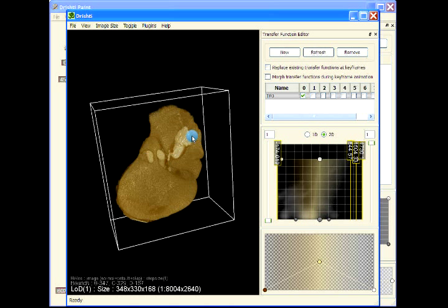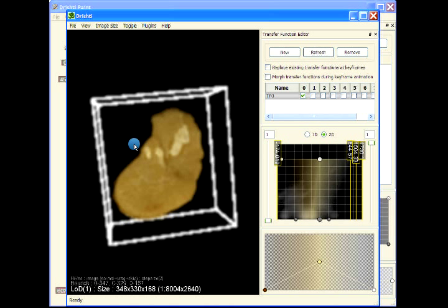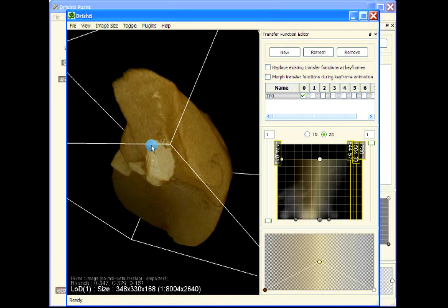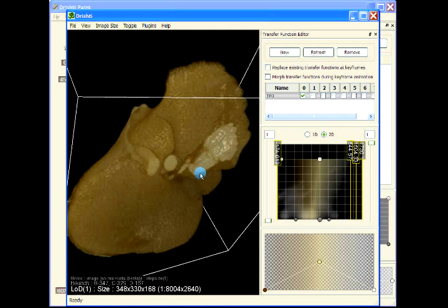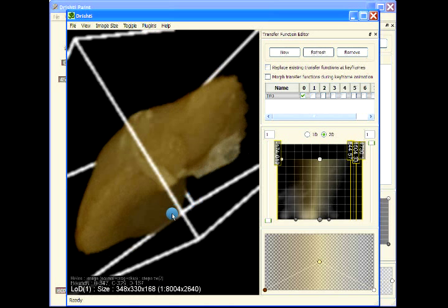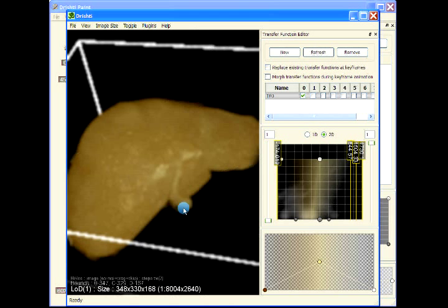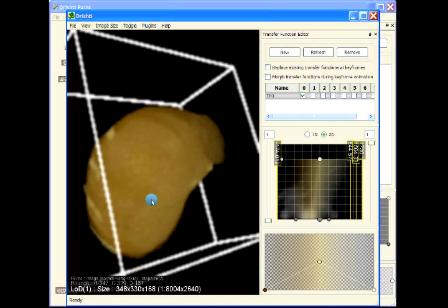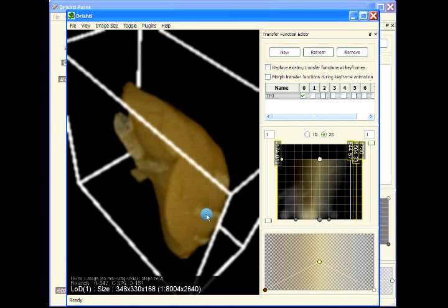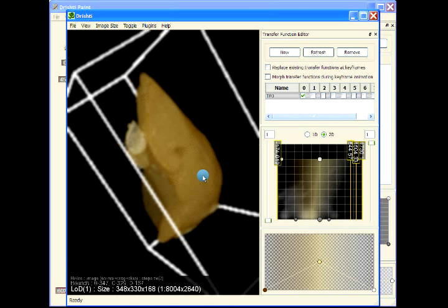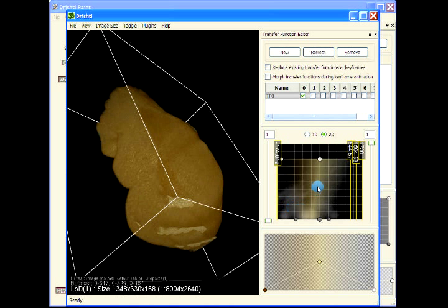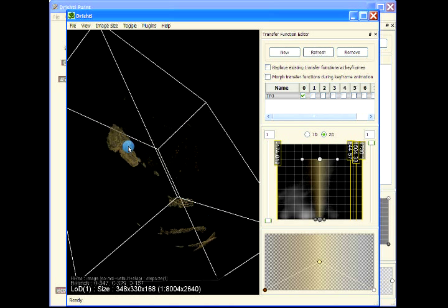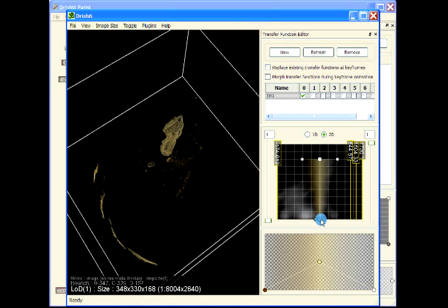I don't know whether this is part of the liver or not, but if it's not, we can go back and update our masking. Even here, that's definitely part of the ribs poking through, and that we can also update in our masking. That's the region here.